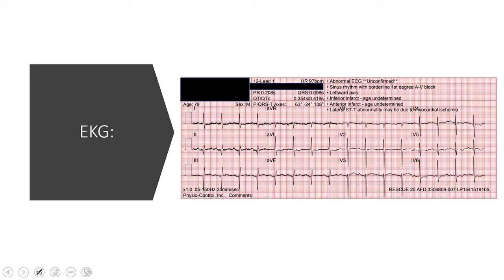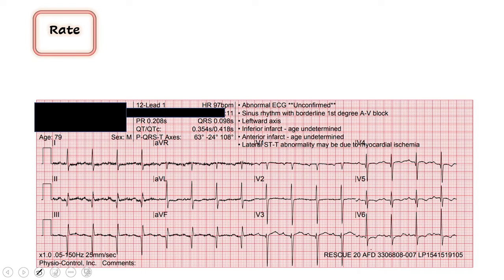I'll let you take a look at that for a second and come up with your own diagnosis, and then we'll go through it together. So as we start, same way every time, we look at our rate. Rate is 97. I'm going to just check with my thick red line and make sure that marches out. The QRS lines up on the thick red line — 300, 150, 100, just less than 100. I agree with the computer.